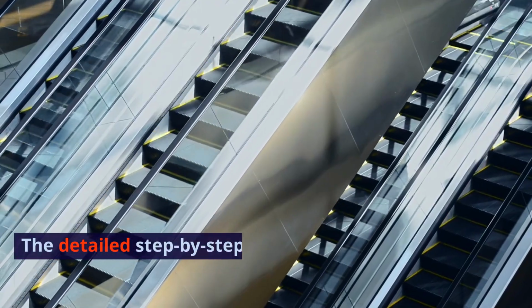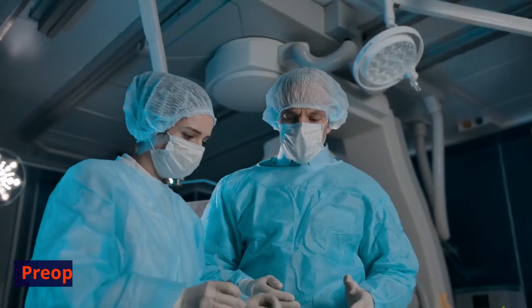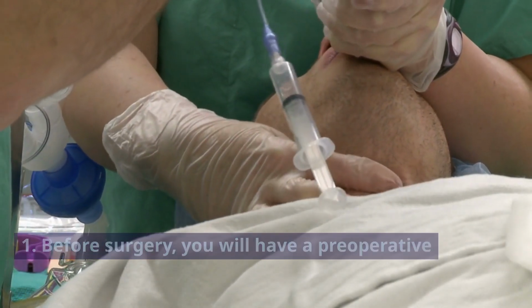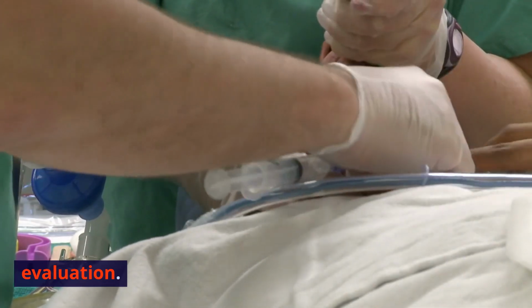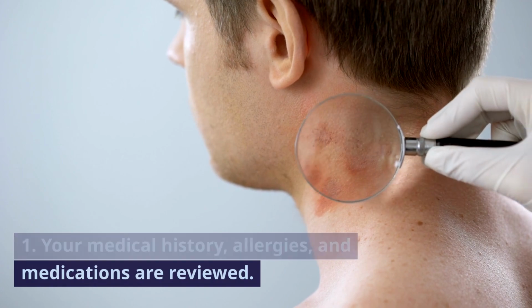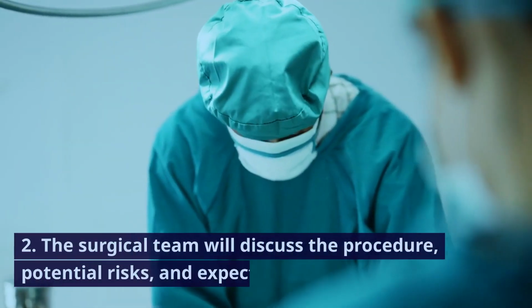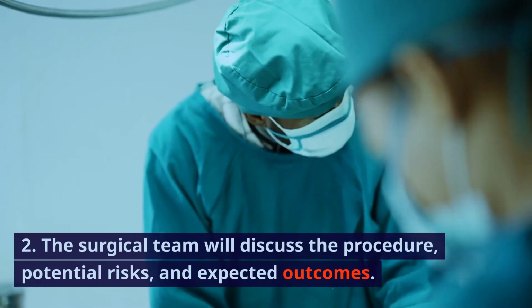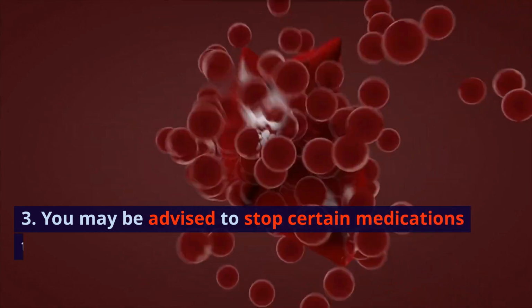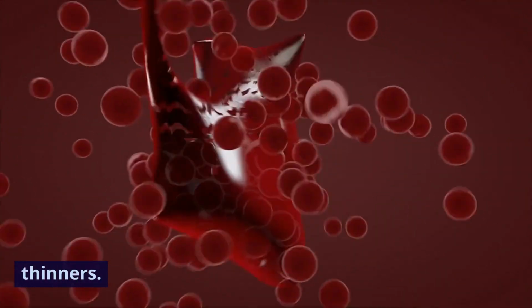The detailed step-by-step breakdown of the procedure. 1. Preoperative preparation. 1. Before surgery, you will have a preoperative evaluation. 1. Your medical history, allergies, and medications are reviewed. 2. The surgical team will discuss the procedure, potential risks, and expected outcomes. 3. You may be advised to stop certain medications that can increase bleeding risk, such as blood thinners.